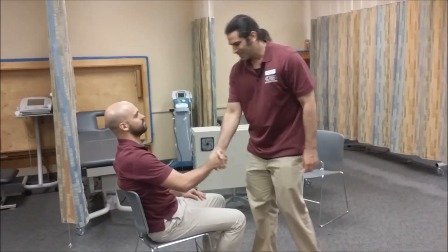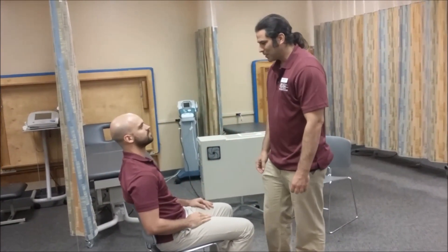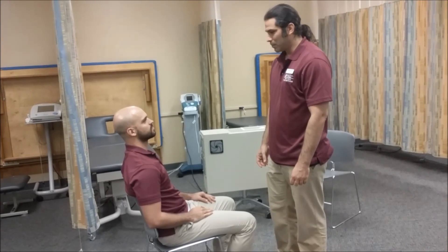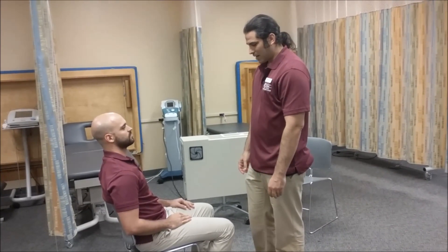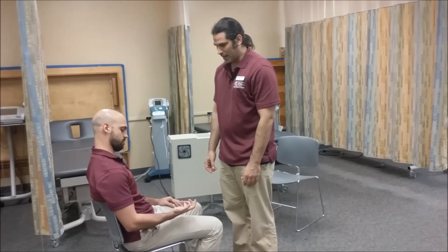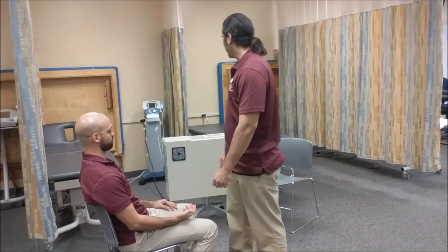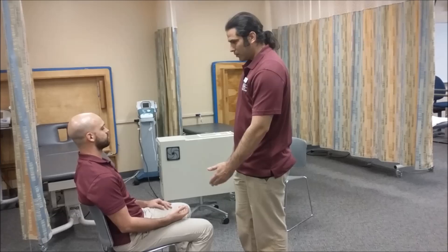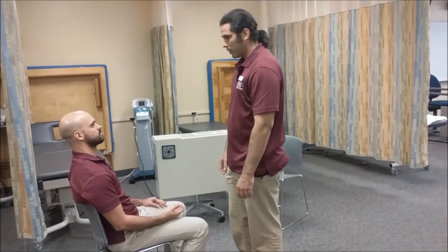Good afternoon, Mr. Lopez. How are you doing? My name is Michael. I'm going to be your physical therapist assistant student today. I read in your chart that you have arthritis in your right hand. So today we're going to perform fluidotherapy to help you decrease your pain and increase mobility.